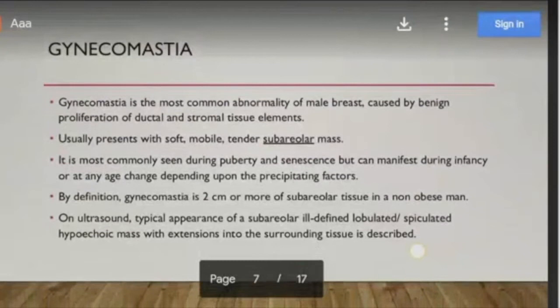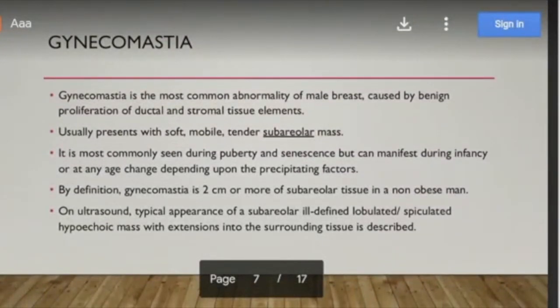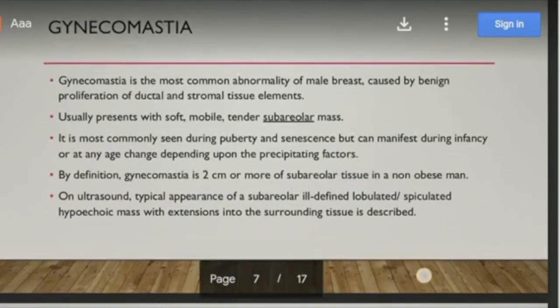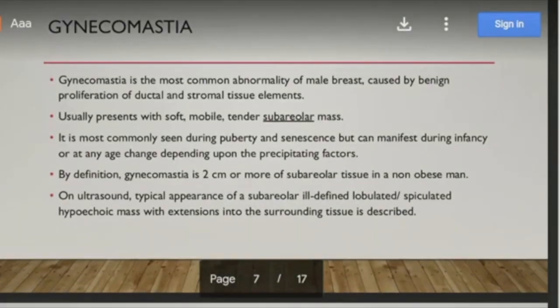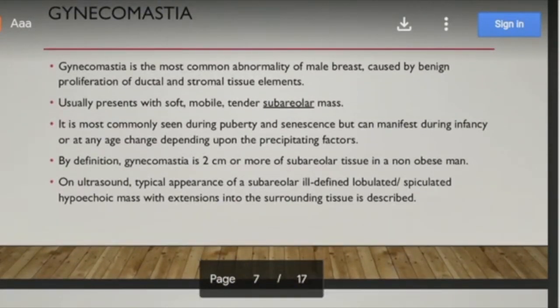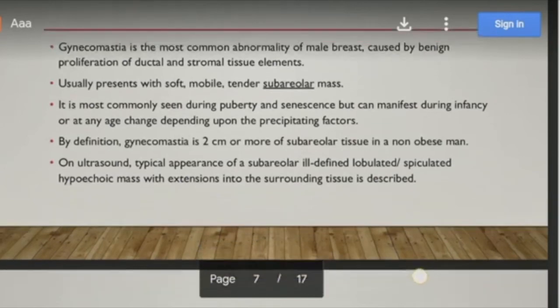Gynecomastia usually presents with a bilateral, soft, mobile, tender subareolar mass. The usual age of presentation is puberty and over 50 years. By definition, it is a subareolar mass of two centimeters or more in a non-obese man. On ultrasound, the typical appearance is a subareolar, ill-defined, lobular or spiculated hypoechoic mass with extensions into the surrounding tissue.